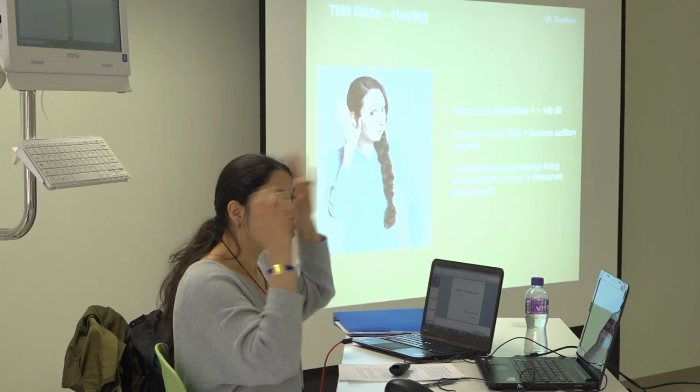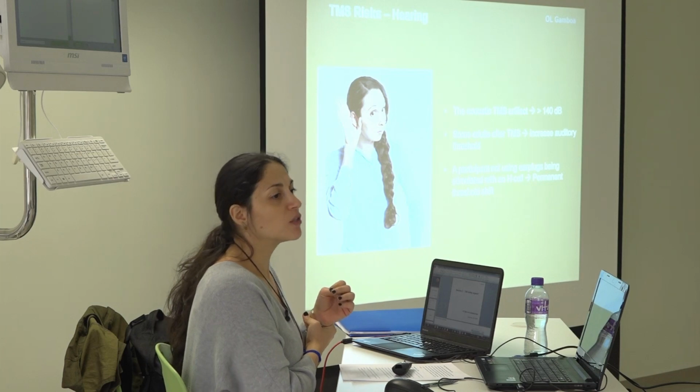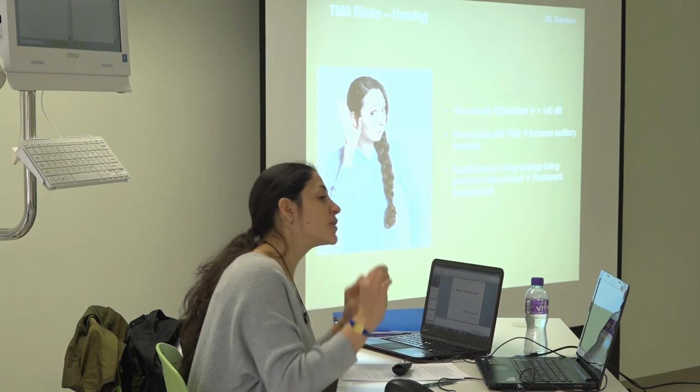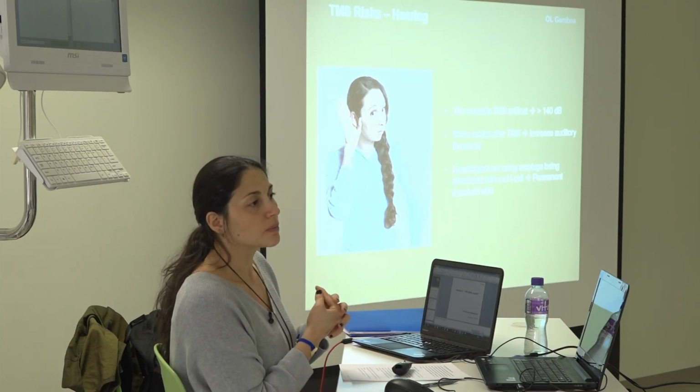earplugs and with an H coil, remember I showed you this H coil that was so strong, had a permanent threshold shift of audition. So it's quite important. In our lab, everybody uses earplugs. It's compulsory. The operator would also be good to do it, but the person who is being measured, seated there, should use earplugs.